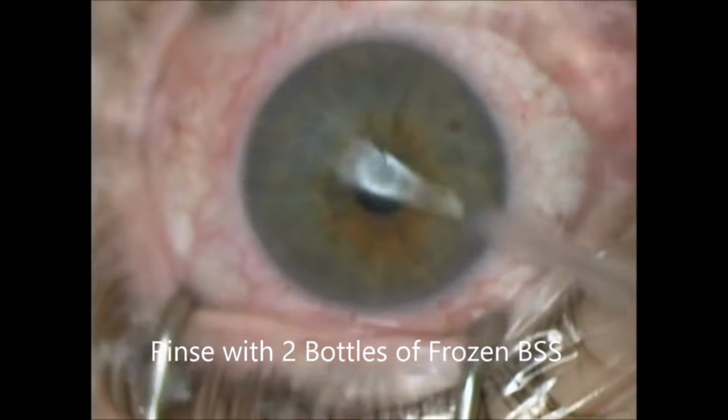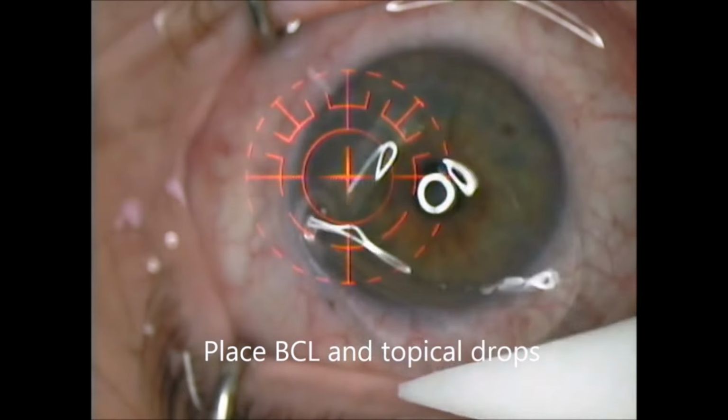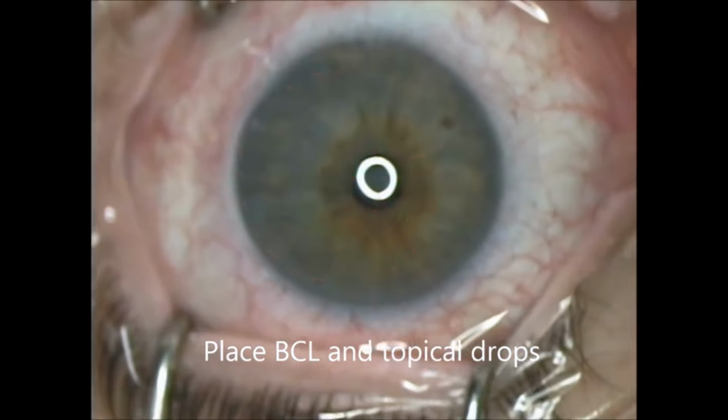I copiously rinse the eye with 2 bottles of frozen BSS. And then following this, basically we'll place a bandaged contact lens, following the placement of non-steroidal anti-inflammatory drops, as well as a steroid and antibiotic. And that's pretty much the case in its entirety. Thank you.